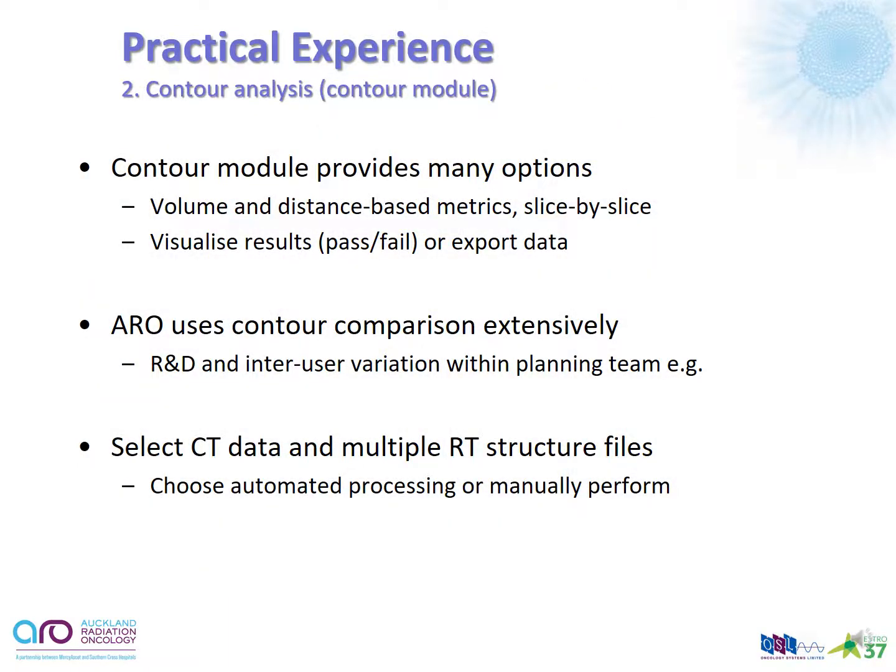The second area of our practical experience I'll cover is the contour analysis area, or the contour module in ImSimQA. And this is an incredibly powerful module that provides many different options for comparing contours on a CT image set. There are various volume and distance-based metrics that are produced slice by slice or for the entire organ at risk. And also we're able to visualize the results, look at a pass or fail using contour distance maps, and also export text-based files of the data.